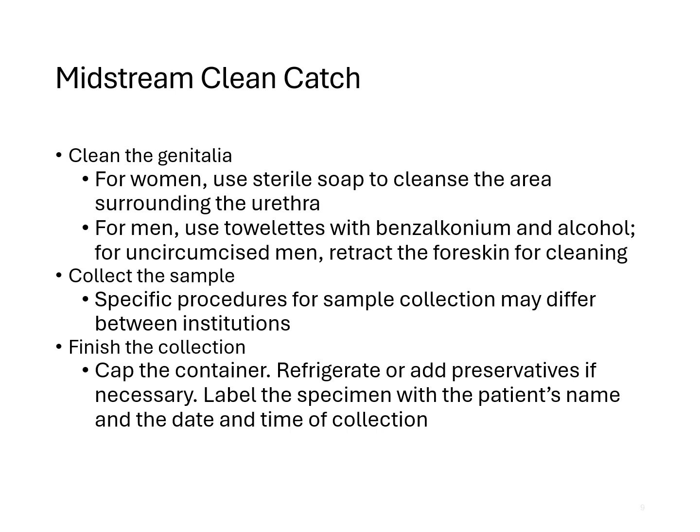Collecting the sample, the specific procedures may differ between institutions, but generally after they do the cleaning, they're going to want them to go a little bit in the toilet, and then as the name suggests, collect it midstream. So they'll let a little bit out, and then they're going to try to collect the rest of it in a cup. And then they are going to finish the collection.